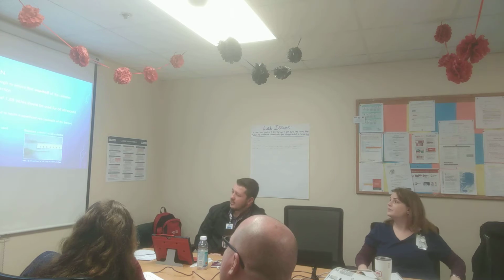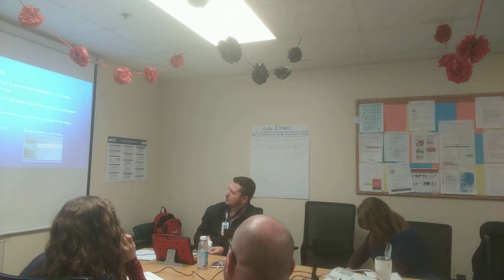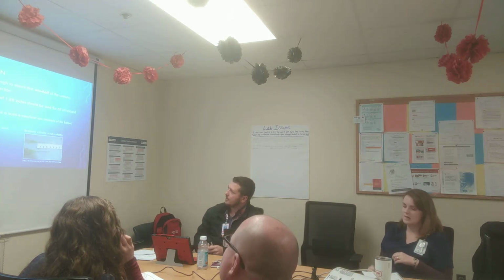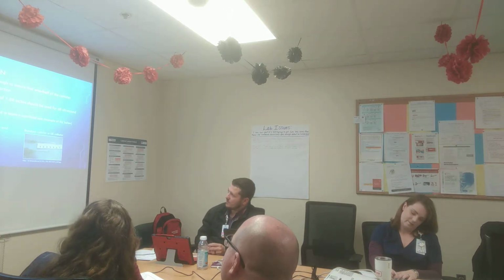So this is a catheter selection. I'm going to pass these around, let y'all look at them. Ultrasound catheter is a lot longer than the normal catheter length. This ensures that one half of the catheter resides in the vessel after insertion.